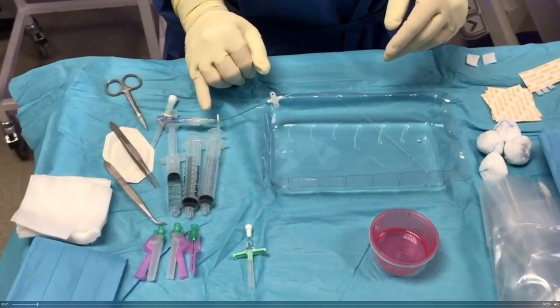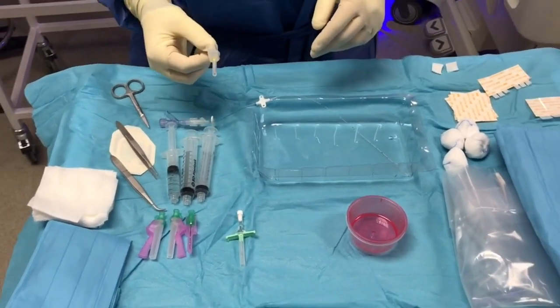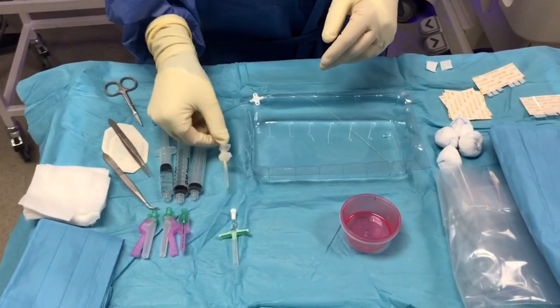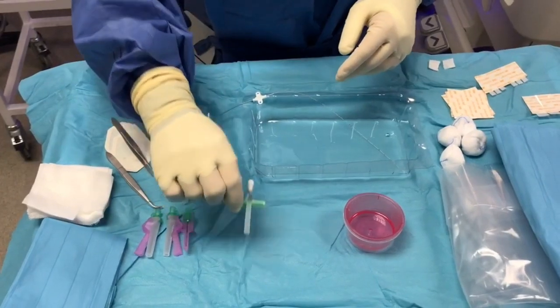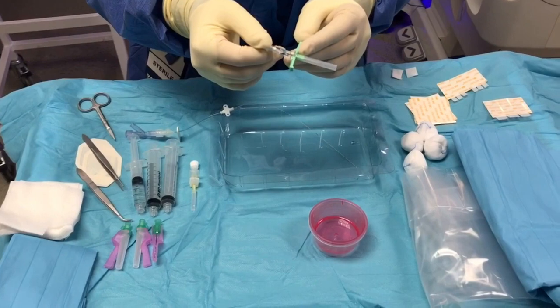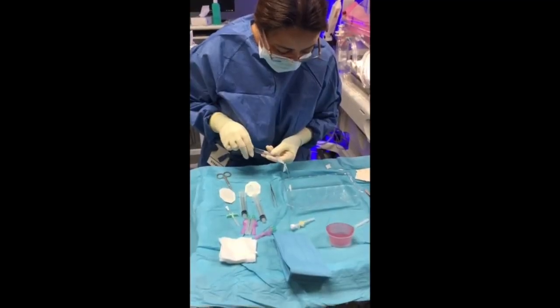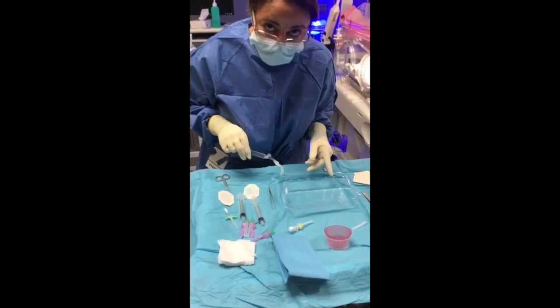In this video you can see that we are using the PICC with stylet. We will be using a 24 gauge yellow cannula to feed the line through. However, if the vein that you have chosen is large enough, you can use a splittable needle supplied with a PICC. It is really important that the entire catheter is flushed through with normal saline right to the tip.